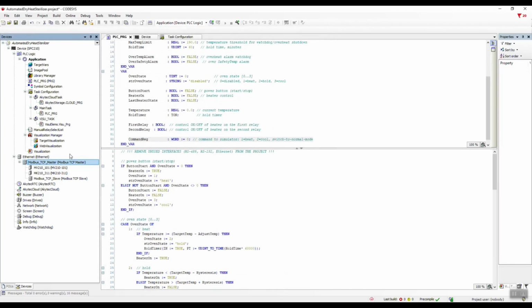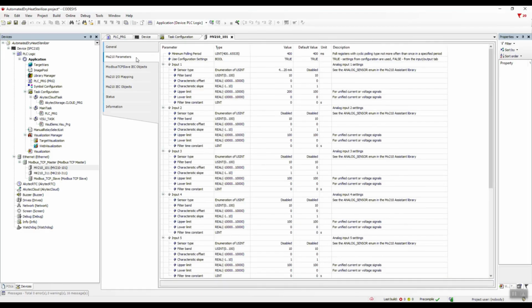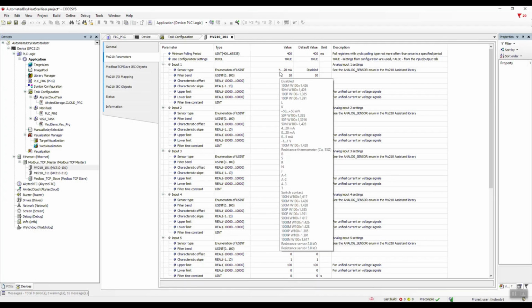This template, developed by akYtec, frees the user from needing to know what Modbus is, meaning you don't have to spend time studying documentation, the module's register map, or worry about how to properly configure a bunch of parameters to form requests, or rearrange registers to get correct data and convert them to the required types. In this template, all the data has already been processed, and all we need to do in the settings for the first analog input is select the 4 to 20 milliampere measurement mode.